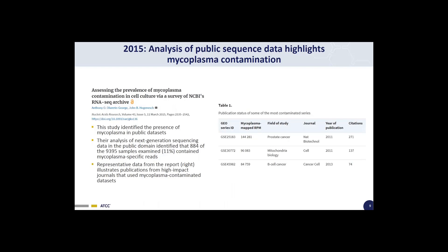Fast forward to 2015 — the advancement of new technology, such as next-generation sequencing, allows us to survey mycoplasma contamination from cell culture in novel ways. A recent study published in Nucleic Acids Research assessed the prevalence of mycoplasma contamination in cell culture by surveying NCBI's RNA-Seq archive. High-throughput RNA sequencing data is growing at an exponential rate. The authors predicted that mycoplasma sequences in RNA-Seq data from primate and rodent specimens would be indicative of contamination. Their analysis identified that 884 of 9,395 samples examined — or 11% — contained mycoplasma-specific reads.